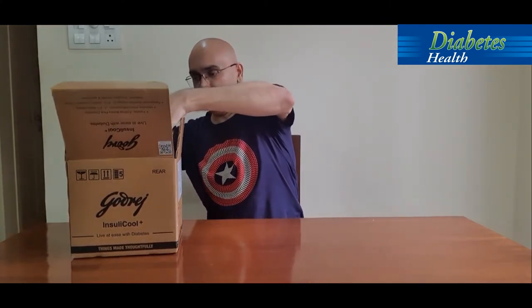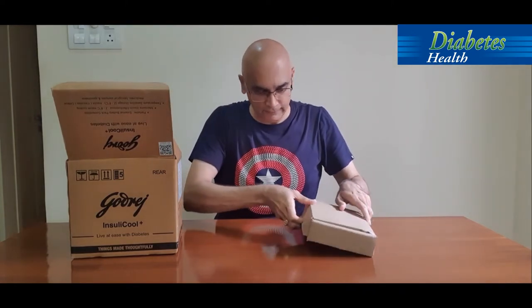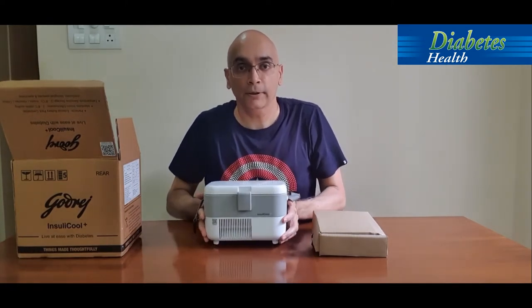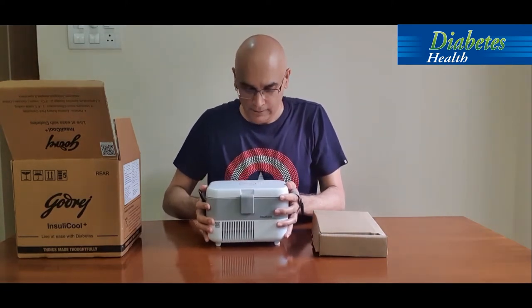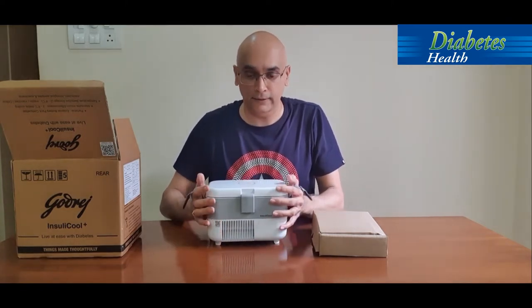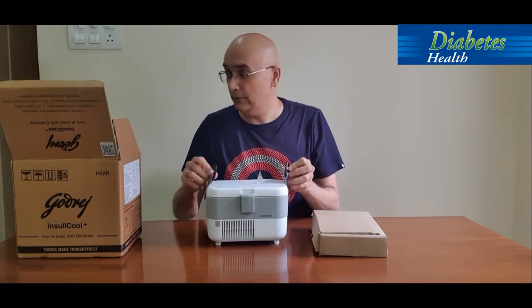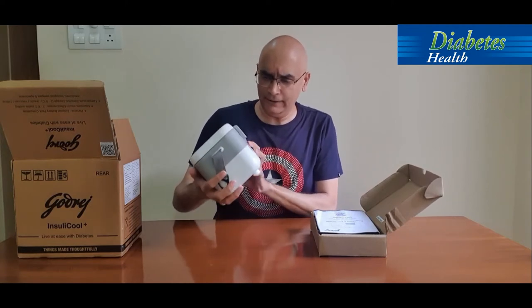First up, we have a lot of accessories here. The product itself is like a mini refrigerator especially for insulin — it stores insulin at between two to eight degrees Celsius, which is very important to maintain. It comes with a nice shoulder belt, and it's very light at just one and a half kilos, so it can be carried easily.